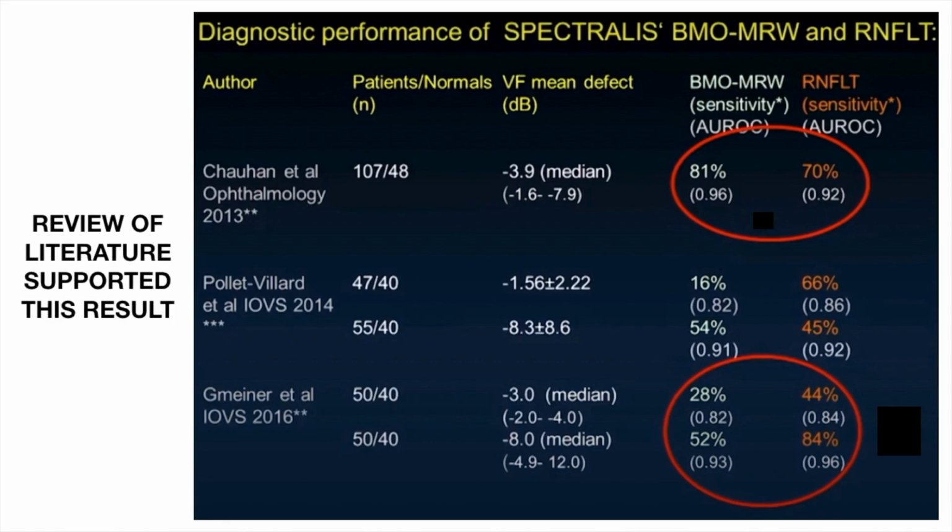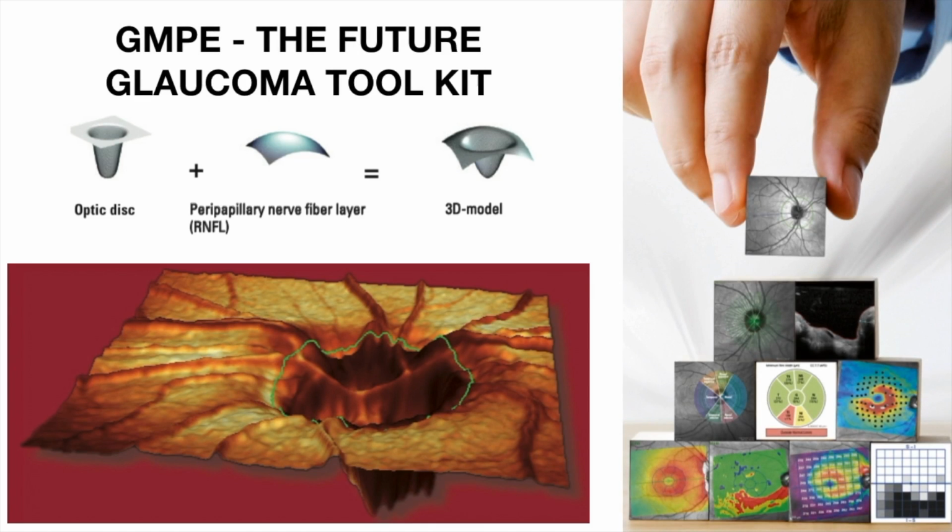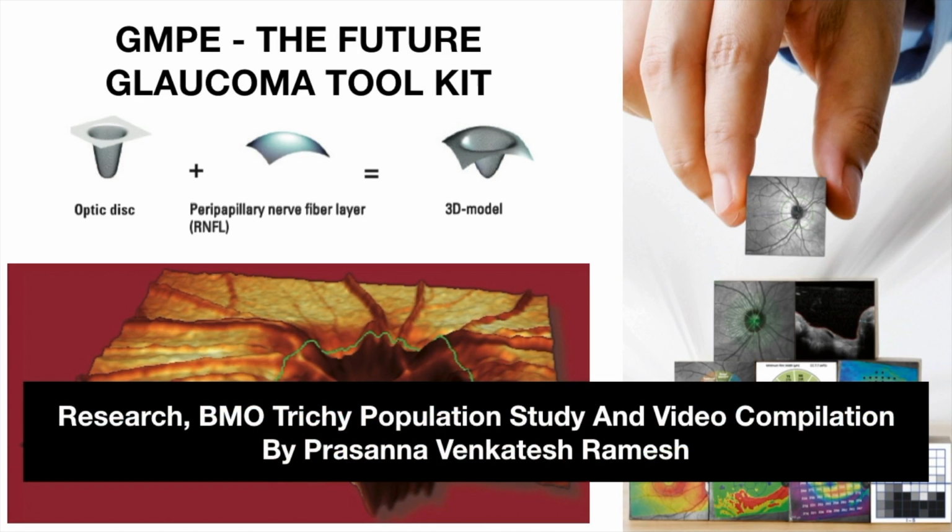Review of literature and other studies also supported this result. GMPE is a promising glaucoma toolkit which helps in serving the glaucoma patient better.